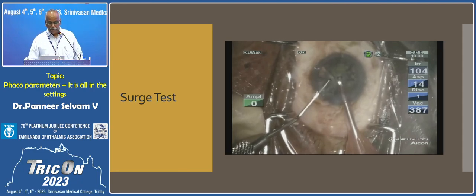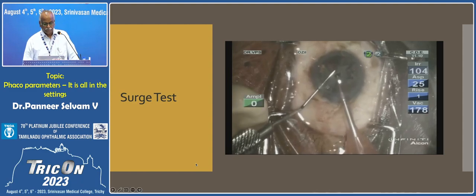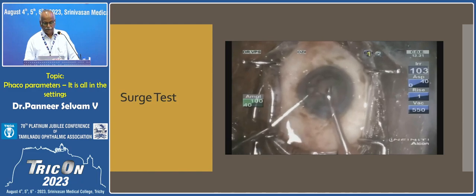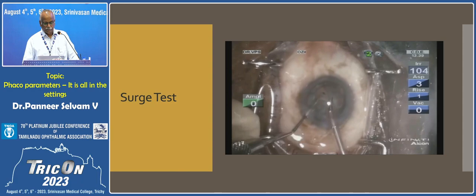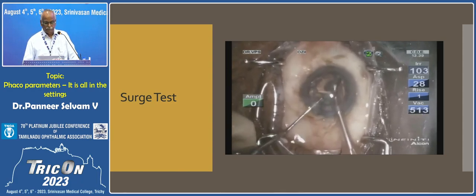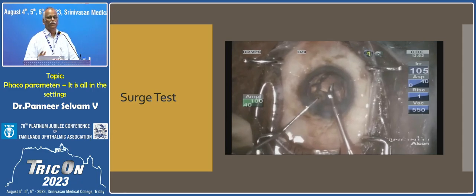At 550, you'll just see. Now I set it at 550, just watch. So there is a forward movement. That is the limit of that machine. So your limit should be much below. You don't require that much vacuum in all cases.